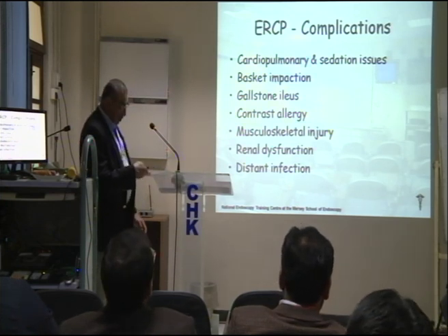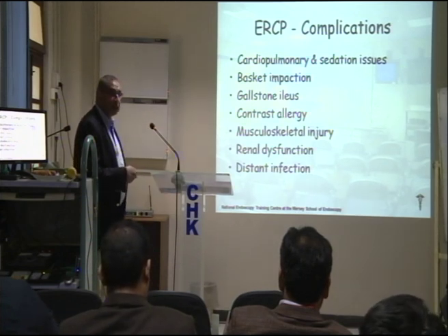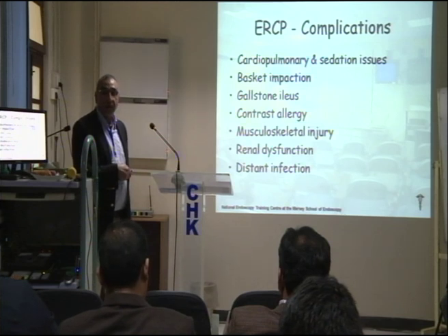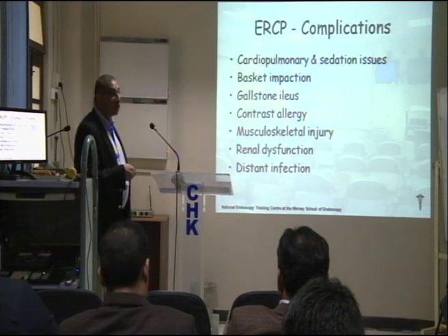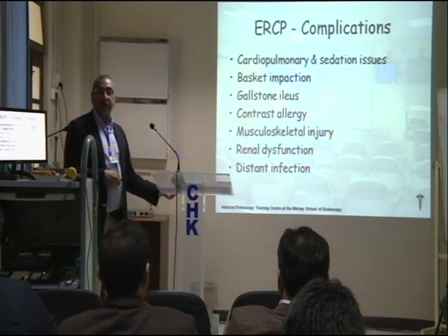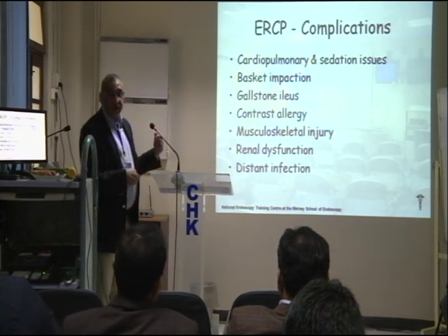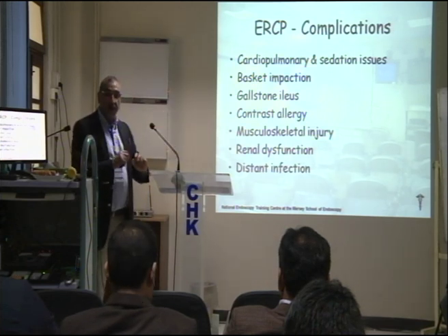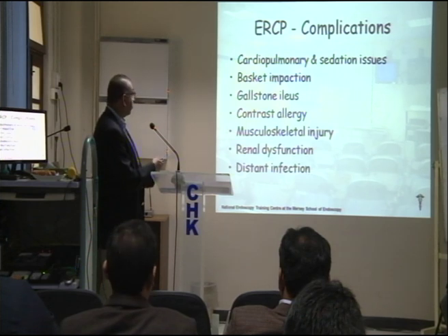Right. Other issues are cardiovascular and pulmonary issues, especially in patients with COPD. Basket impaction is a fairly rare but embarrassing complication of ERCP, because if you are not judicious about the size of the stone and the type of basket you use, you might get it impacted, and it is very difficult to dislodge at times, and you might end up with the strands of the basket sticking out of the patient's mouth. So try to avoid that. Sometimes you've got these rescue lithotriptal baskets. In case your basket gets impacted, you attach it to that, it cracks the wire of the basket and you can pull it out. Very rarely you would require surgery.